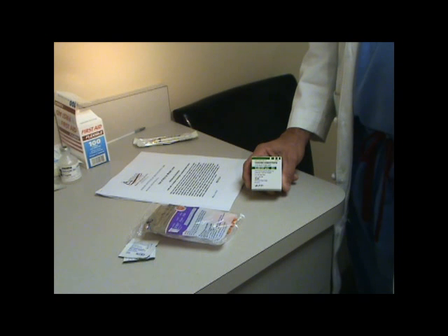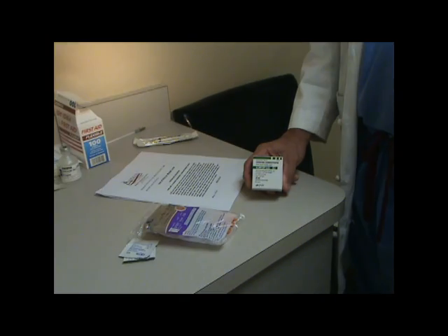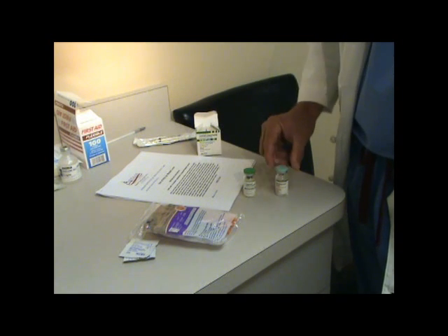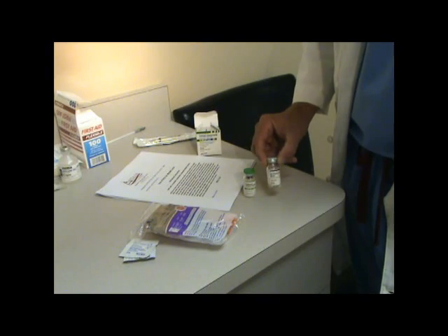These are the items you'll need for preparing the HCG, or human chorionic gonadotropin, for the Anlos Institute HCG weight loss program. Inside the box are two containers: one containing the powder — the green one — and the second, the light blue, is the bacteriostatic water.